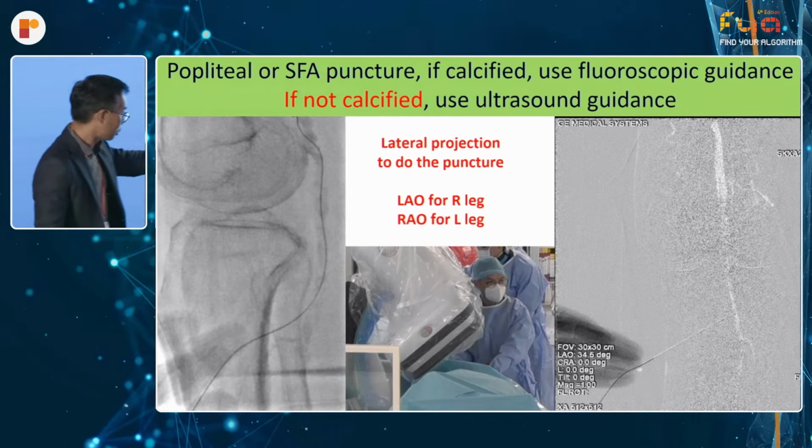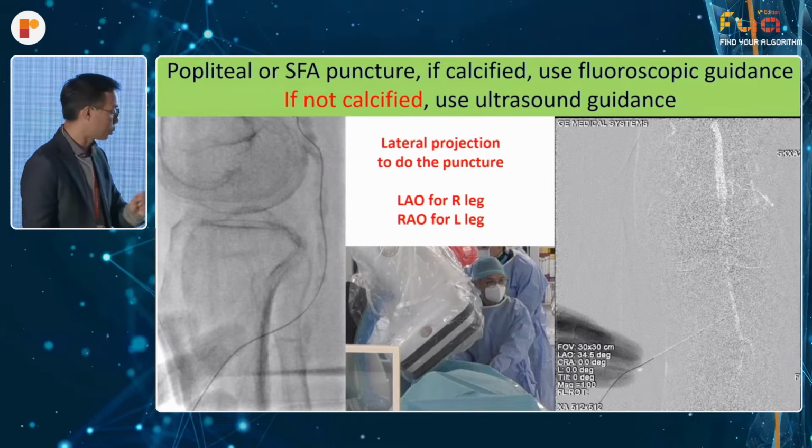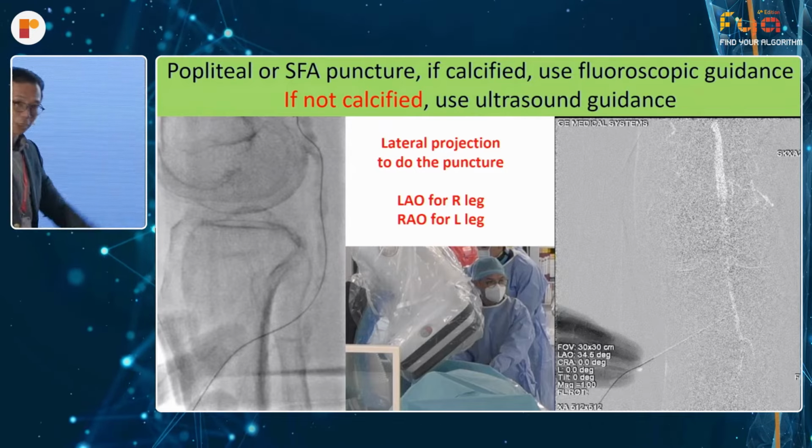So in this case, I was working on the right leg. The projection is LAO, and there's plenty of room to put a needle in there. Again, I use a 21 gauge needle. Everything else is the same, just the projection is important.